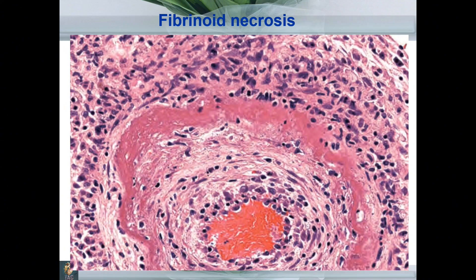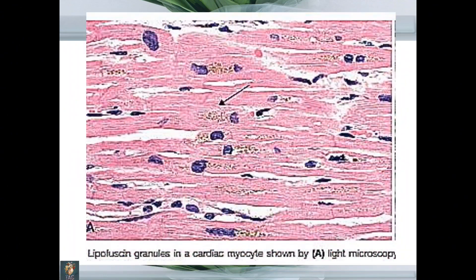This slide shows cardiac muscle fibers. You can see deposits of brown-colored pigment known as lipofuscin, which is the wear-and-tear pigment and is a part of the aging process.